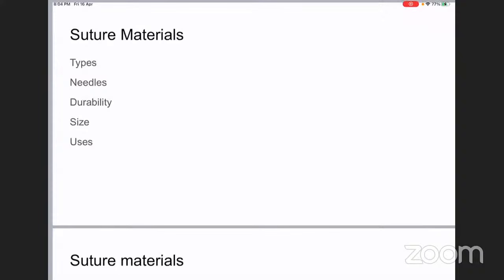This is why we put several throws with Prolene, and put multiple knots of at least 6 knots with Prolene, or polypropylene. Whereas braided or polyfilament sutures do not have memory, so they have excellent knotting property. So when you knot these suture materials, the knot is very secure.